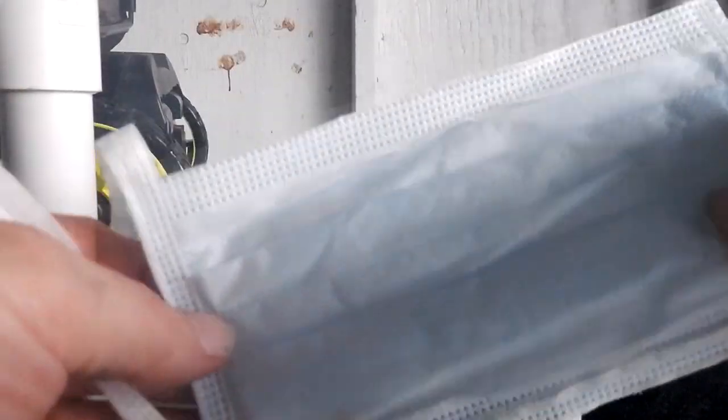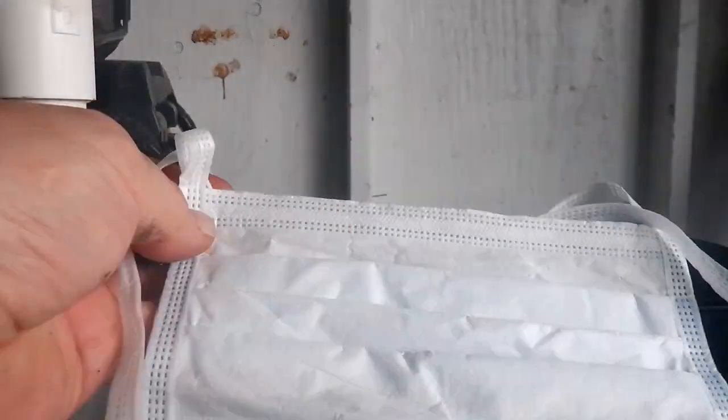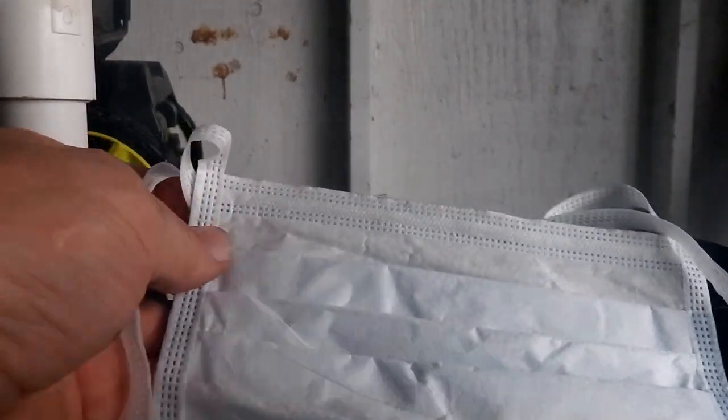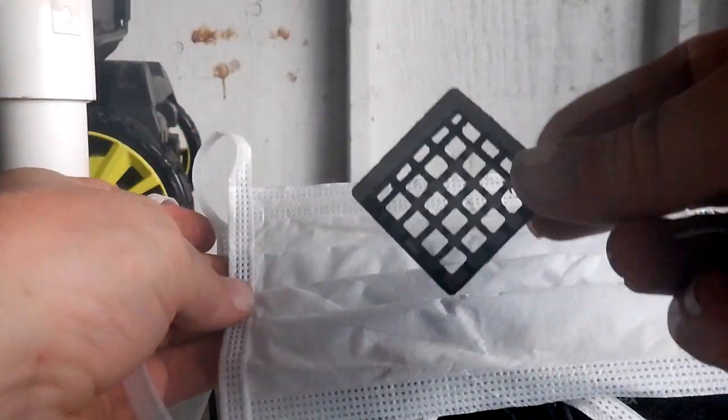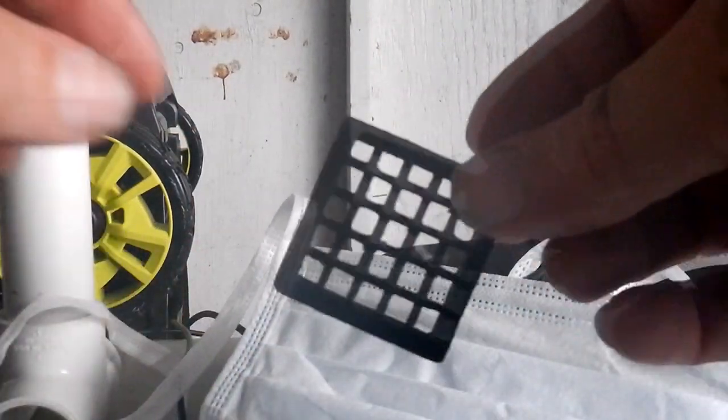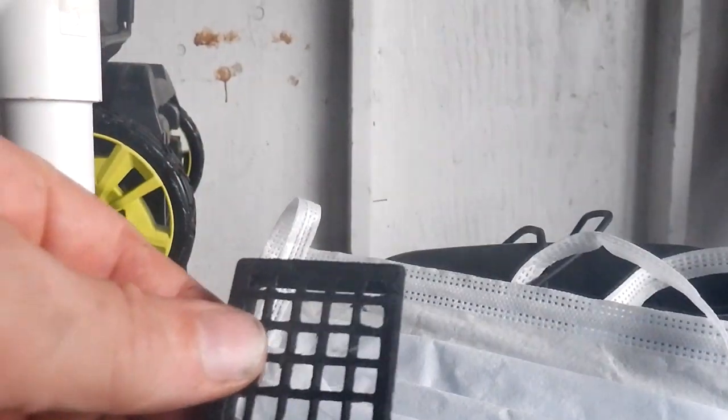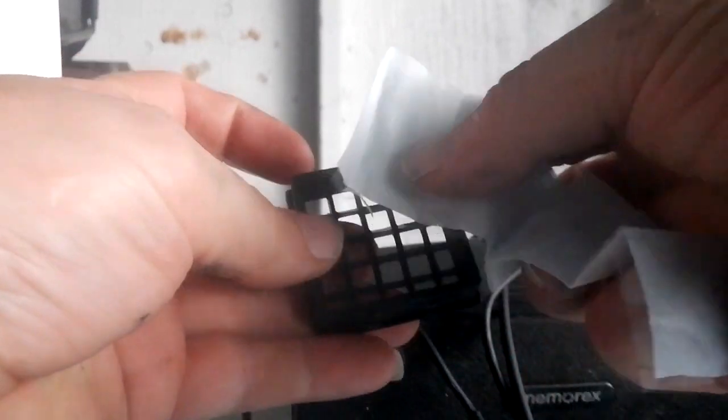Okay so we're going to take this mask and we're going to cut it up the size of that and stick it in there. So this is a strip of that mask here, just going to put it in here.